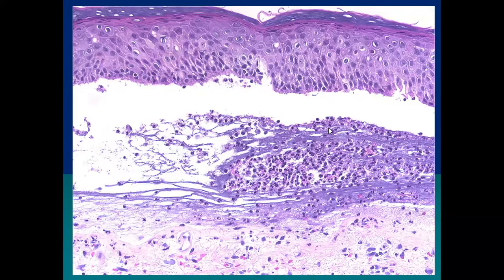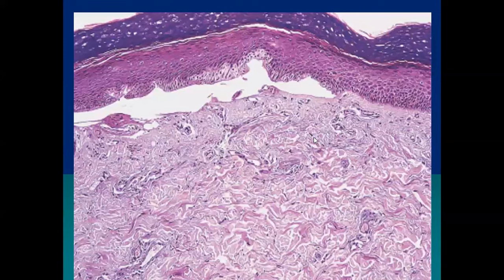In this image there is another subepidermal split with dense inflammatory infiltrate, but this time the infiltrate is mainly neutrophils. A subepidermal blister with predominant neutrophils is primarily linear IGA disease. Additional differentials include bullous SLE and the inflammatory phase of epidermolysis bullosa acquisita.